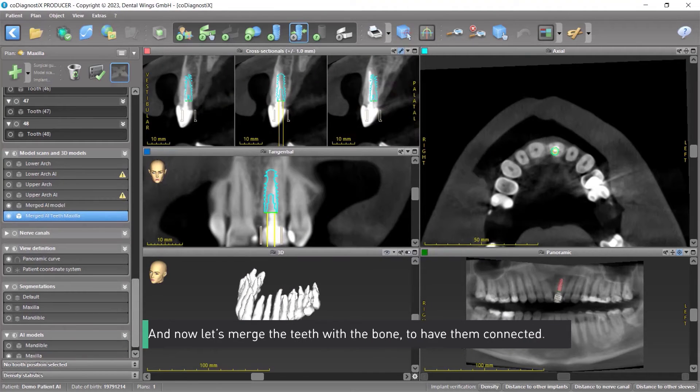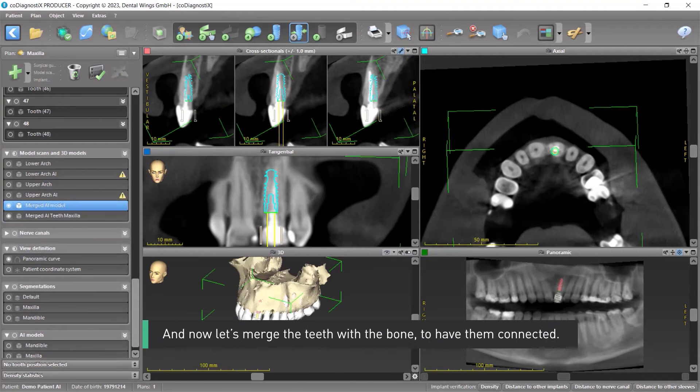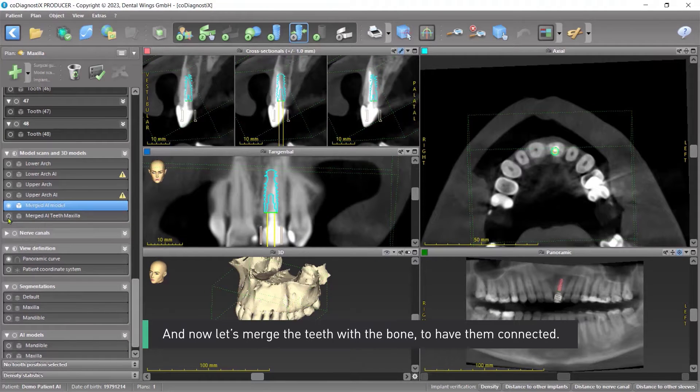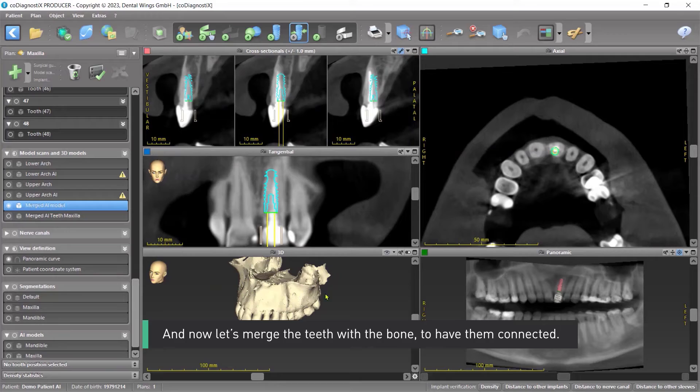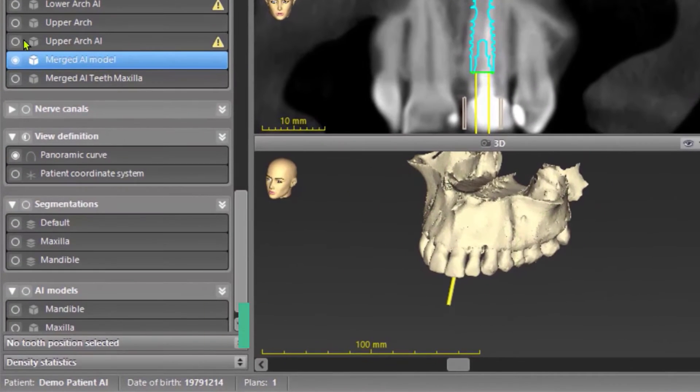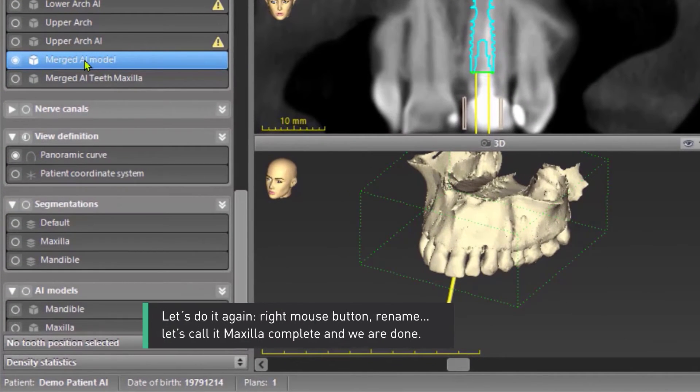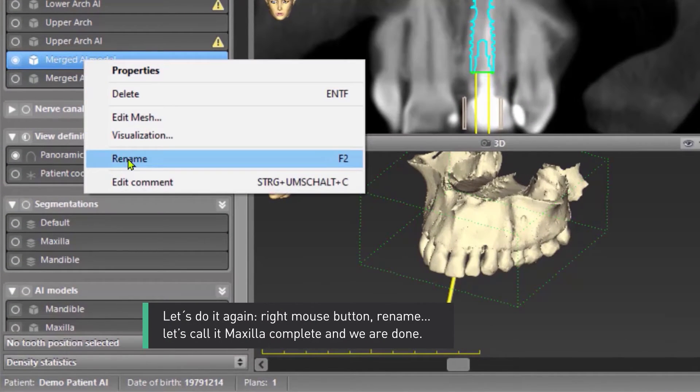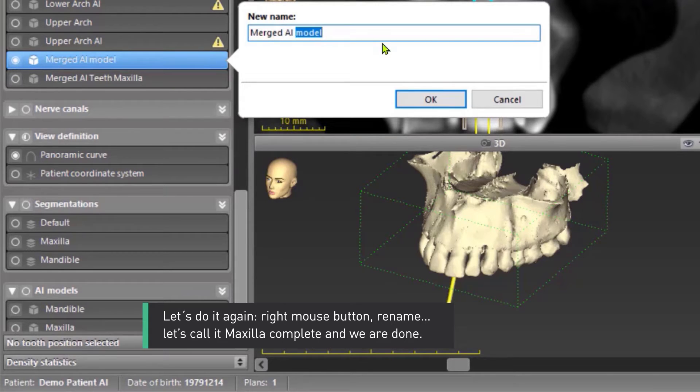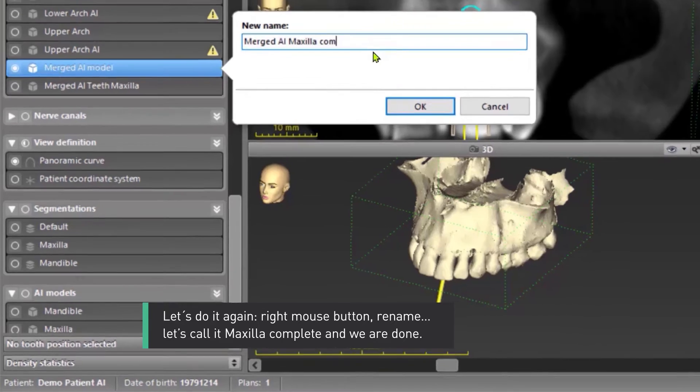And now let's merge the teeth with the bone to have them connected. Let's do it again. Right mouse button, rename. Let's call it Maxilla Complete and we are done.